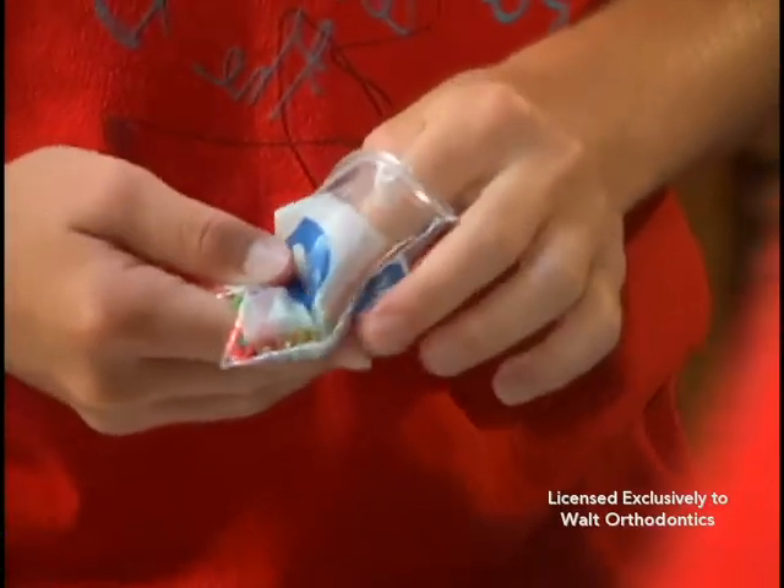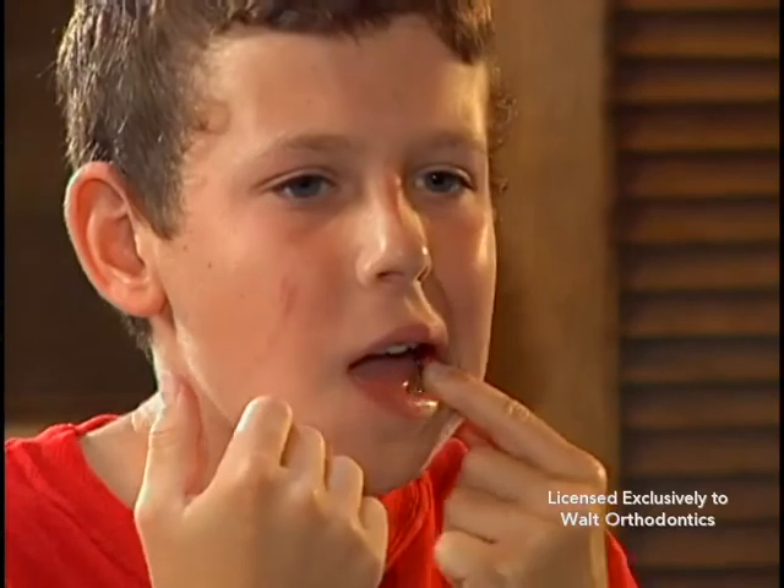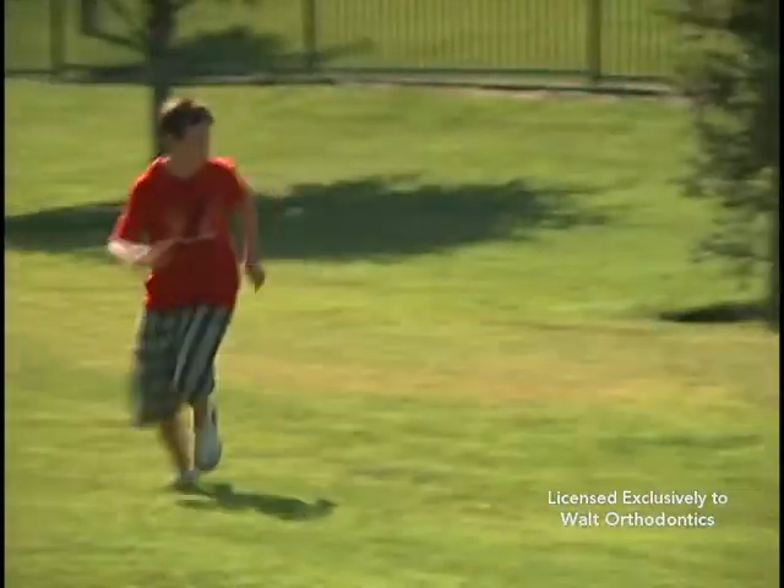After a while, elastics lose their strength. Change them at least after each meal and before bedtime. If one elastic breaks, replace both sides.